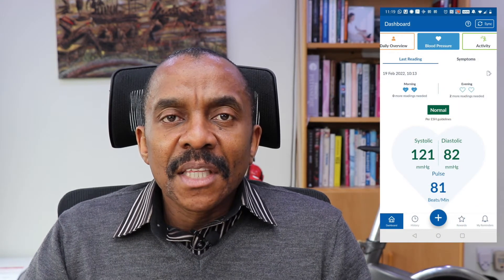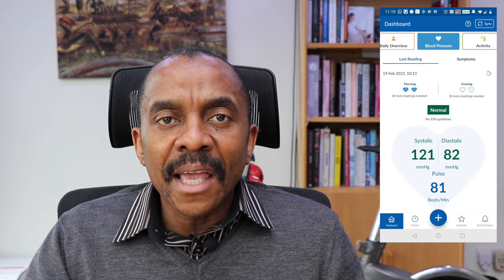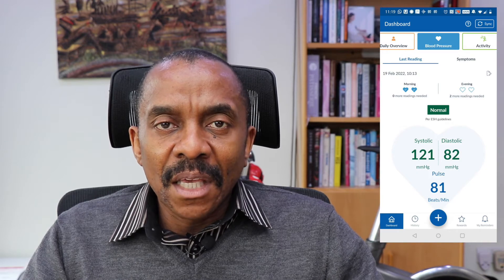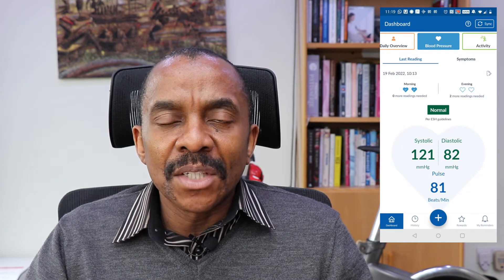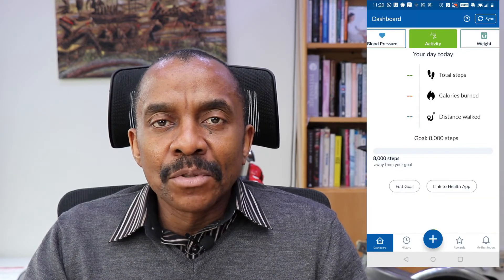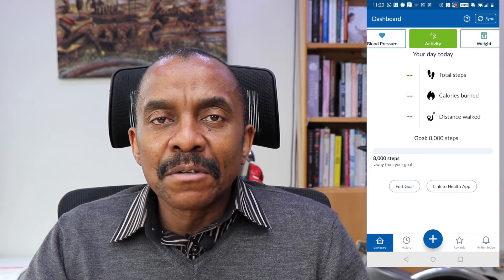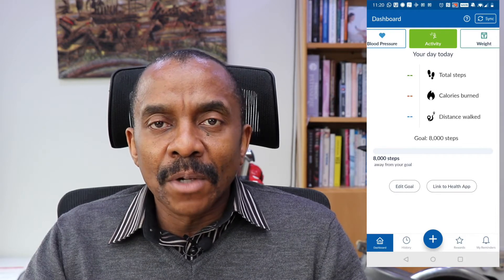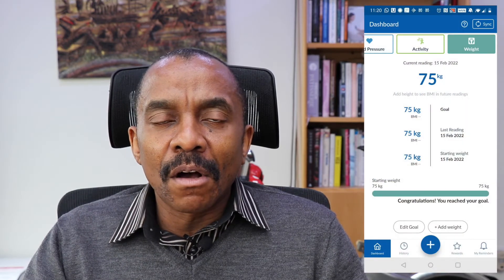When you click on the blood pressure button, the app takes you to another page showing your blood pressure readings for the day. It assumes you take readings in the morning and evening, and displays the average accordingly. The next page is the activity page, which enables you to record the number of steps taken, calories burned, and distance covered during the day — I don't use this feature, but it's available if helpful.